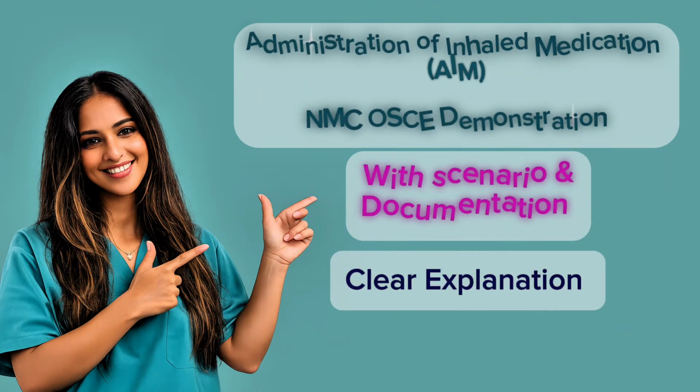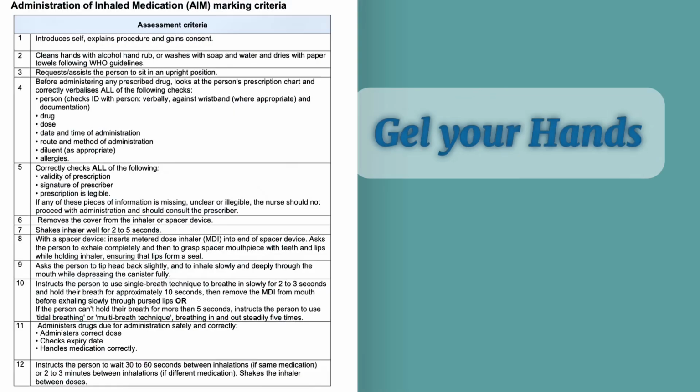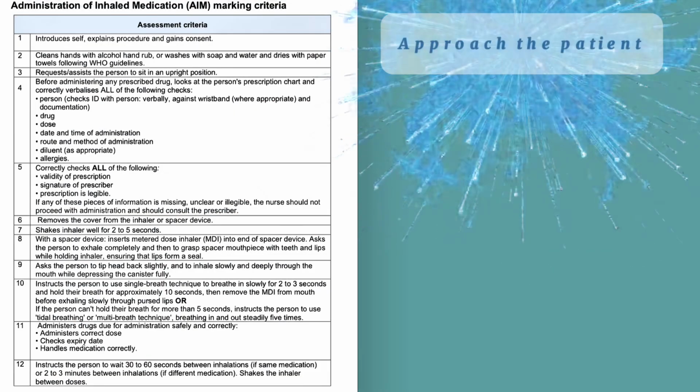So today I will be showing you how to administer inhaled medication. Let's see the procedure. This is the prescription sheet. First, gel your hands. Approach the patient.